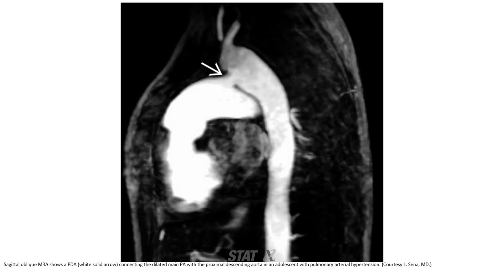Cardiac CTA showed a PDA device already placed, connecting the left main pulmonary artery with the proximal descending aorta in relation with pulmonary artery hypertension.